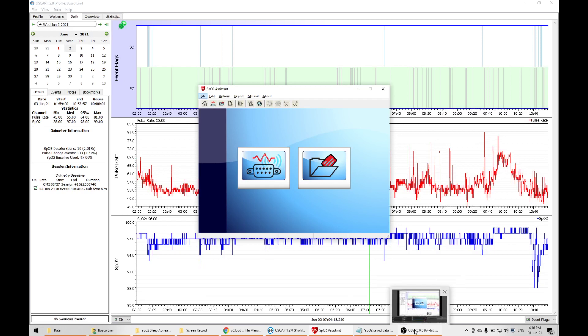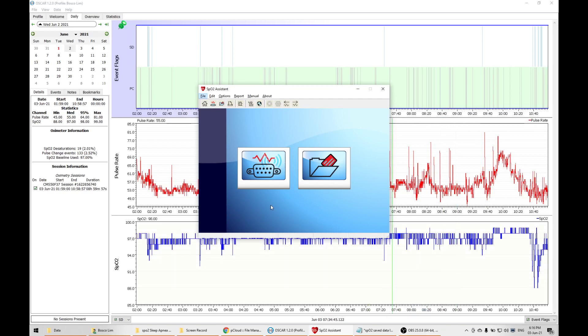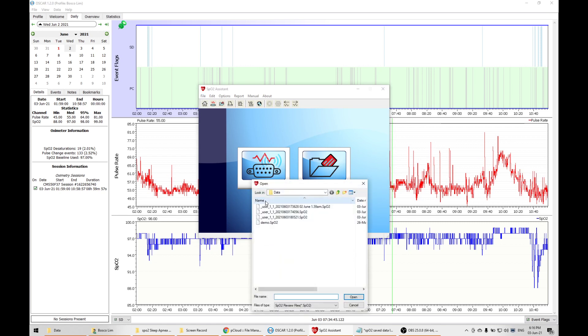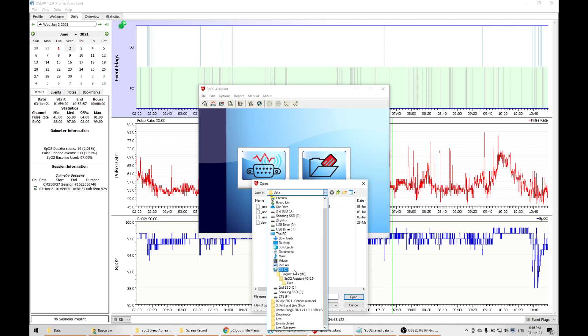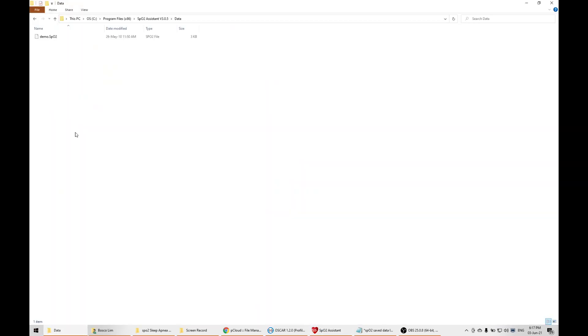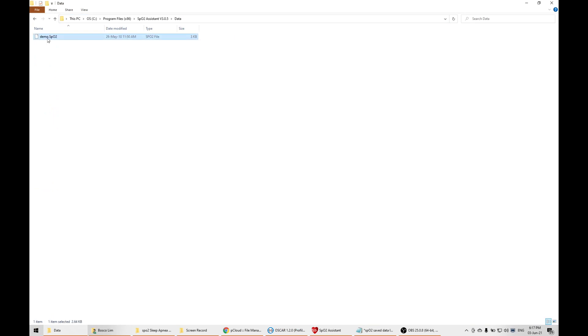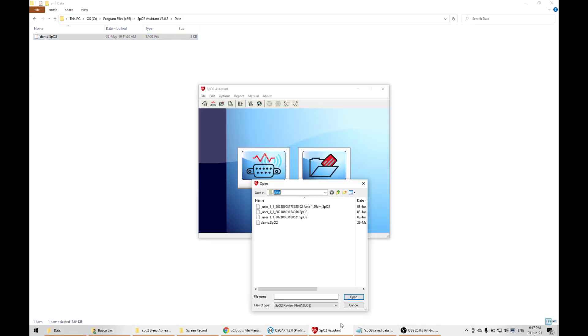Hello everyone, this video will show you how to find files extracted from your CM50D Plus Contec. When extracted, I realized these files are not easy to find. If you go to the link C drive program files SPO2 data, you'll see the real link only has one demo file instead of all the files.